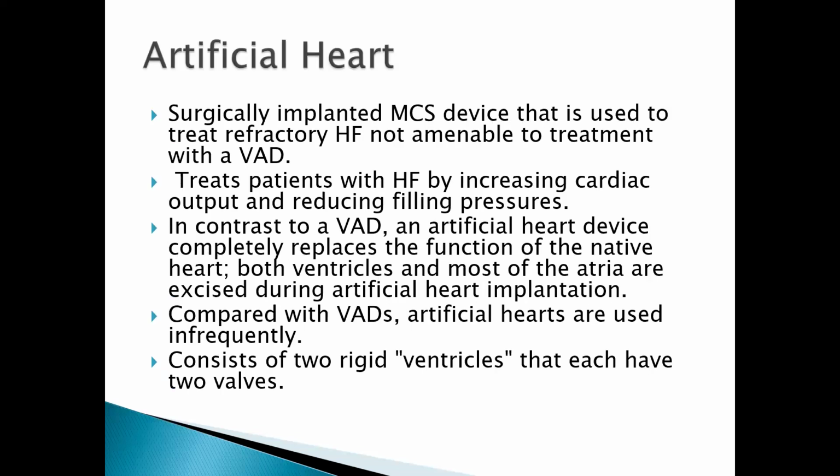Next slide. So I quickly want to talk about artificial hearts. I had to put up this slide because an artificial heart is totally different from a ventricular assist device, from what I heard and read. It's a surgically implanted mechanical circulatory system used to treat refractory heart failure that is not amenable to treatment with a ventricular assist device. It treats patients with heart failure by increasing cardiac output and reducing filling pressures.